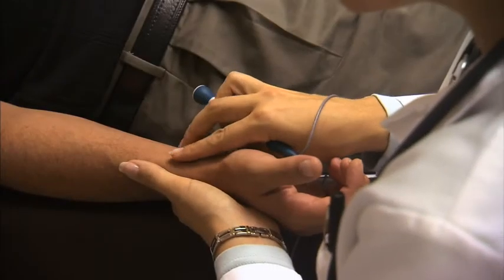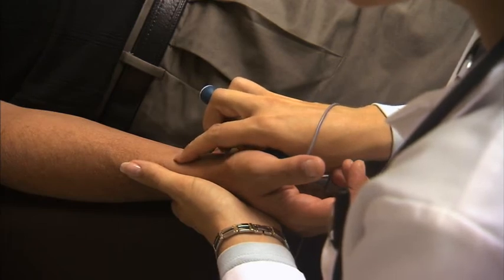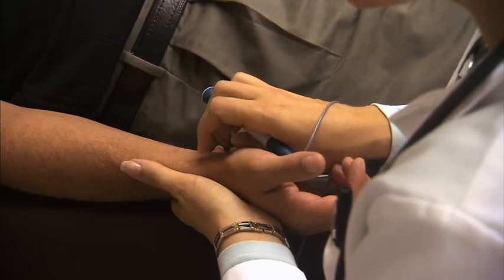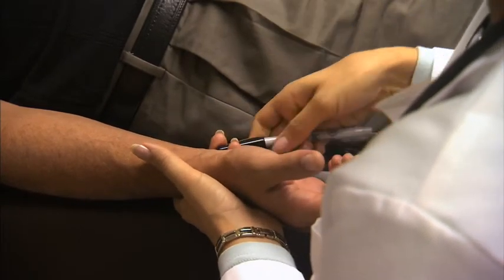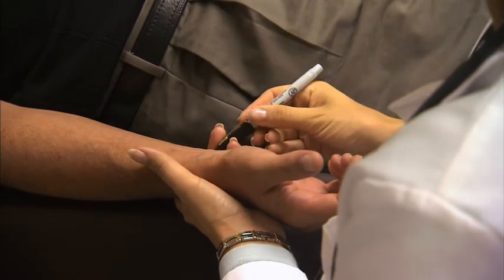To record the radial pulse wave, begin by locating the subject's strongest pulse point. Use just the tip of your fingertip and a gentle touch. Applying too much pressure or using a larger area will make it difficult to locate the strongest pulse point. Once you've located the strongest pulse point, you may wish to mark it, or simply note a nearby mole or freckle.